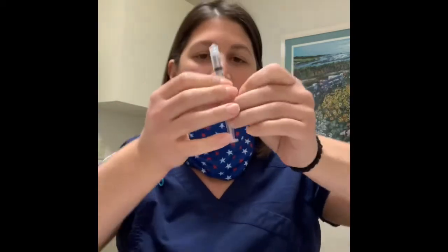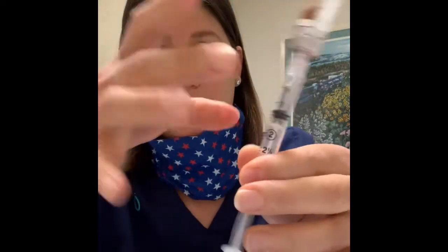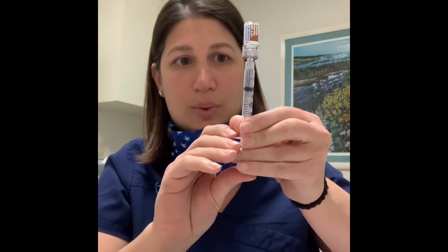Take your 3cc syringe, open that up, and draw up one cc of air. You can see on the syringe there's a thicker line at the one — you're gonna go up to that. You're gonna put the air in the syringe, take the syringe and twist it onto the Q-cap. Turn it upside down, push all the air into the vial, then pull out past the one. If there are any tiny air bubbles, you can tick them out, then just push up to that one.